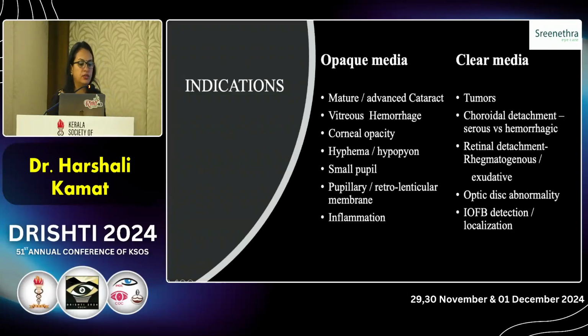So it's a go-to imaging in opaque media, in cases of mature or advanced cataract, in cases of vitreous hemorrhage, corneal opacity, hyphema, hypopyon, small pupils, retrolenticular or pupillary membrane, and in cases of inflammation. There are other indications in clear media, but they're more in retina clinic.